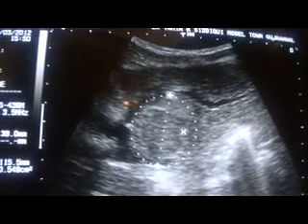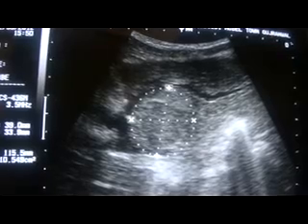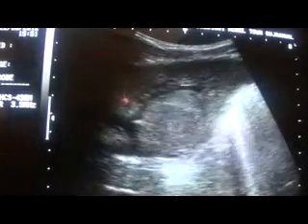So this is in longitudinal section — a solid focal lesion in longitudinal section, and the same in transverse section. This is the echogenic area, a solid focal lesion. This is the echogenic cap over it. This is the ascending portion of the left portal vein, and this is the left posterior branch, and this is the left anterior branch. This is the cirrhotic liver with an irregular outer surface. This is the caudate lobe of the liver. This is the ligamentum venosum, and this is the IVC. So this is the study of a hepatoma or HCC in a cirrhotic liver.